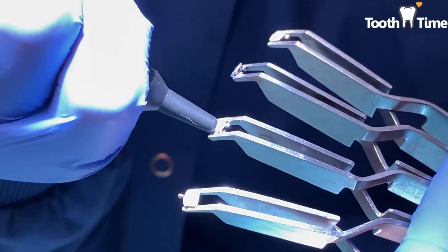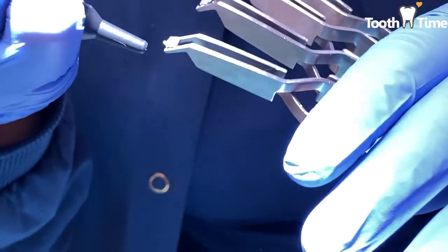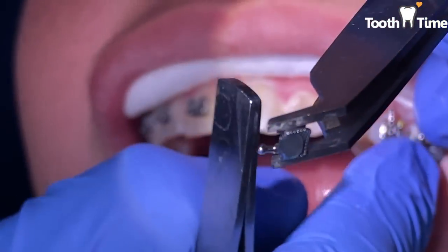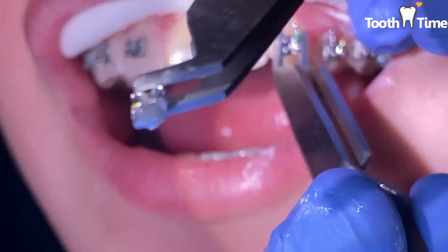Just know that when repositioning brackets, we always use new brackets — we don't put the old brackets back on. The reason is that there's already residue on the previous bracket and there's no way of removing it. A bracket won't adhere well if you put an old bracket back on.